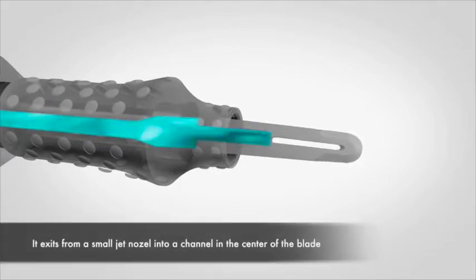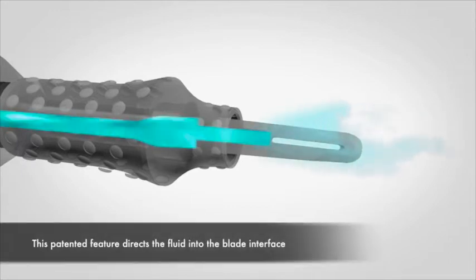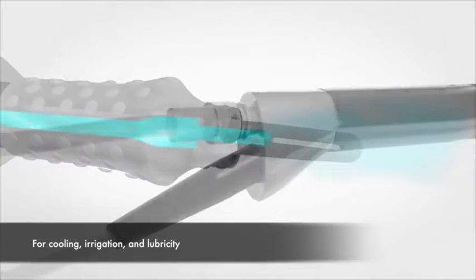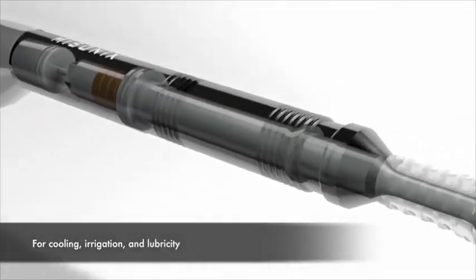It exits from a small jet nozzle into a channel in the center of the blade. This patented feature directs the fluid into the bone-blade interface for cooling, irrigation, and lubricity.